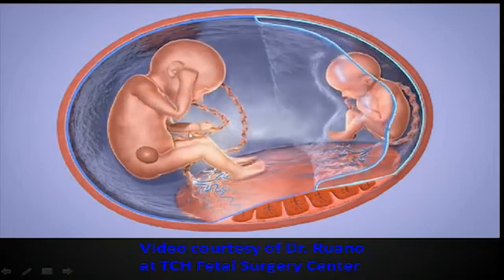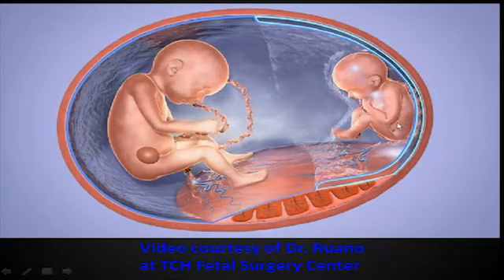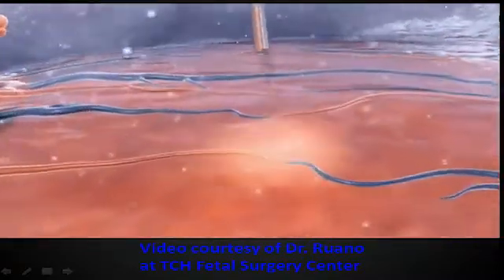You can see how this baby is getting bigger. Look how the bladder's getting bigger, and that one's getting smaller. And this kid is just kind of saran wrapped over there to the side. So now you have the membrane pushed right against that baby.